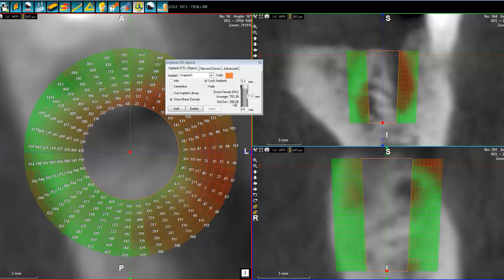This is really something unique to the White Fox. Because if you don't have Hounsfield units that are calibrated, all this information is just rubbish. So that was it for the bone density examination for now.